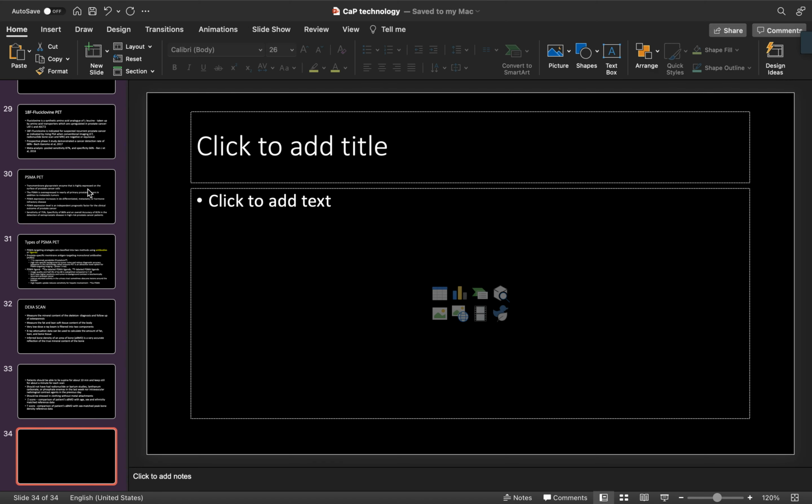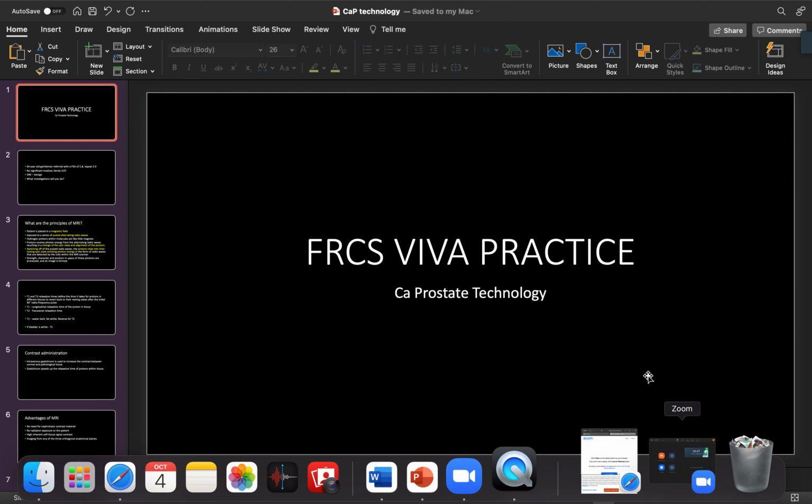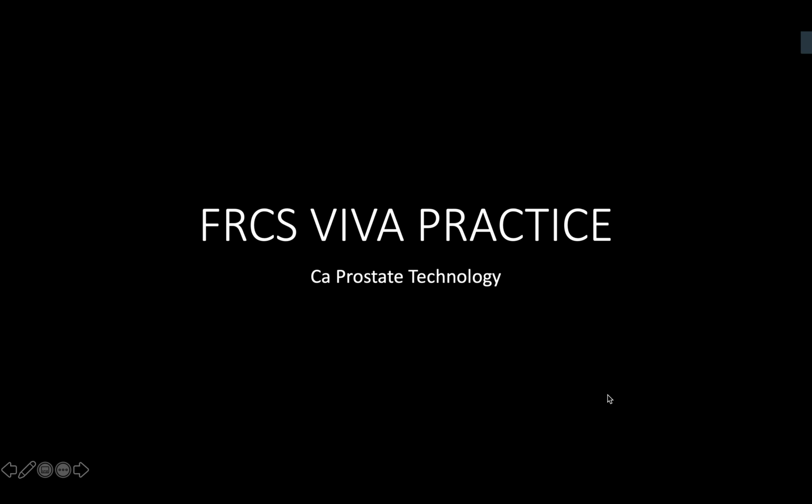If you have gone through the video recording we posted yesterday on BPH technology, for everything there is a keyword. For example, UroLift means nitinol, capsular tab, stainless steel, urethral plate. If you say suture, it means 0.4 millimeter and it works by apoptosis, you may need 2 to 4, usually in even numbers, rarely odd numbers, like that.